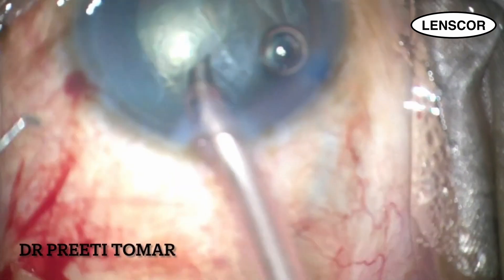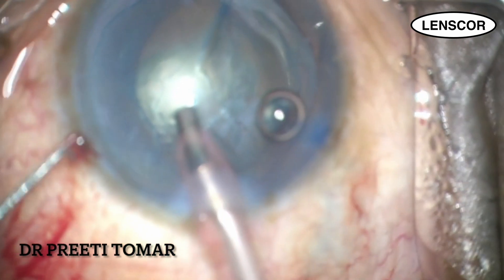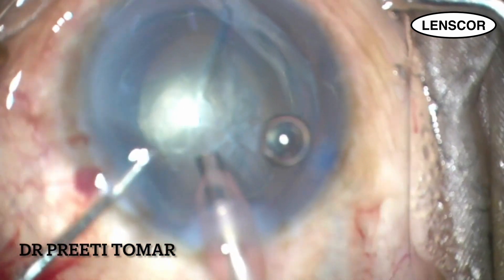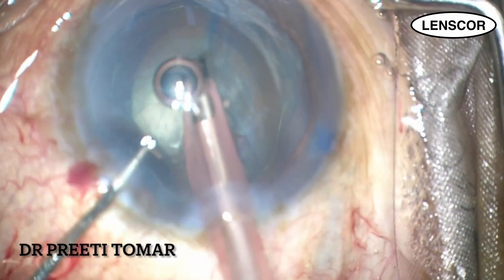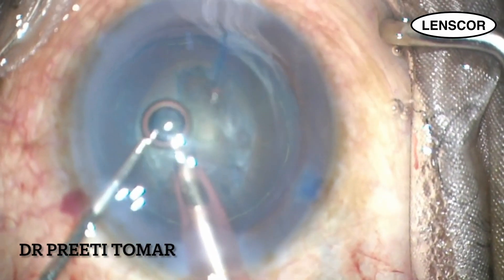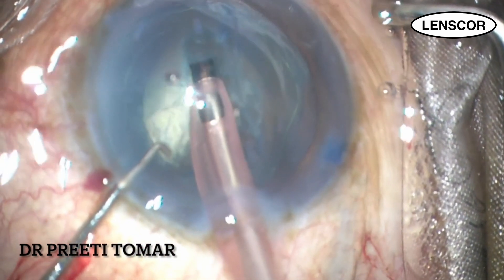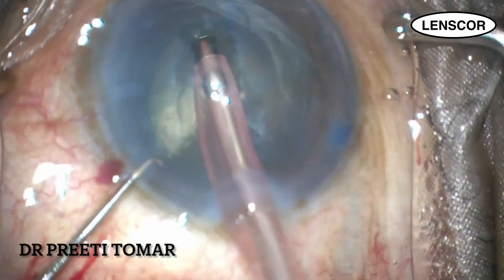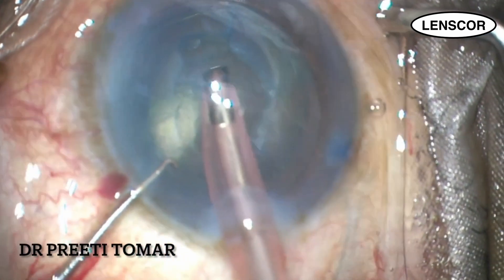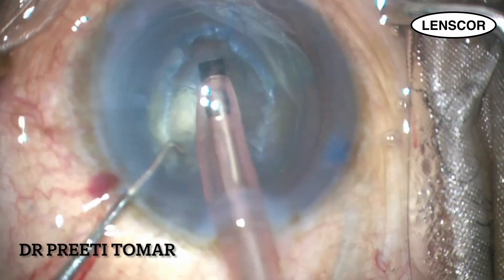Now it's time to emulsify the endonucleus. Being a soft cataract, nucleus management in such cases is not an issue. I begin with the trench and I am going to divide the endonucleus layer by layer, making sure not to disturb the central posterior polar disc. My surgical parameters are kept on the lower side.